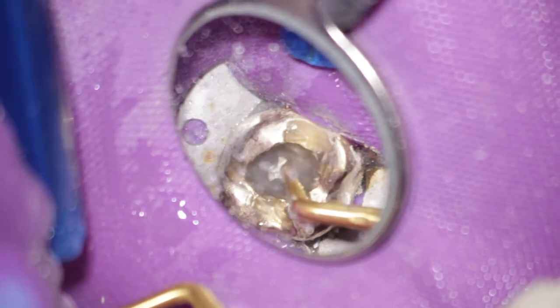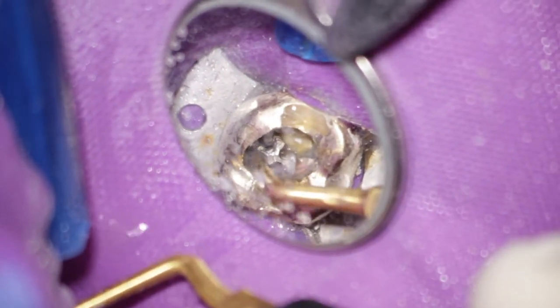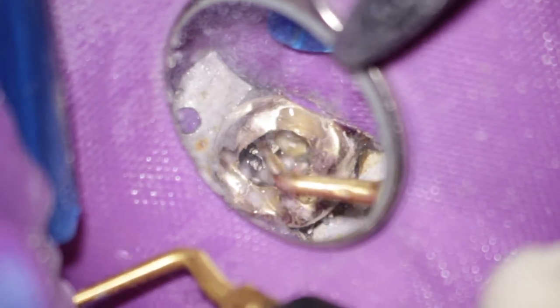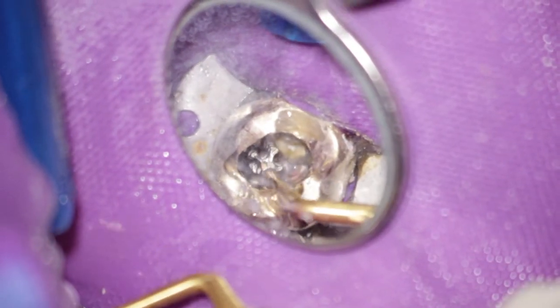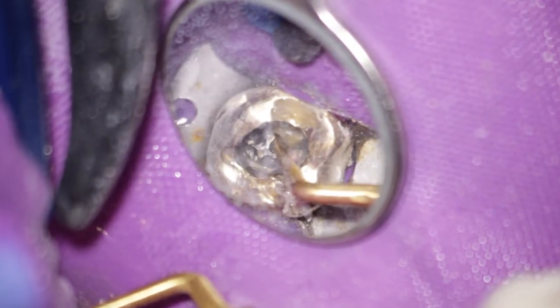Another try to loosen this post. Okay. Now you can see it moves a little bit.